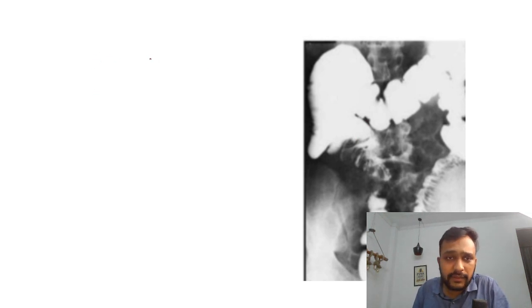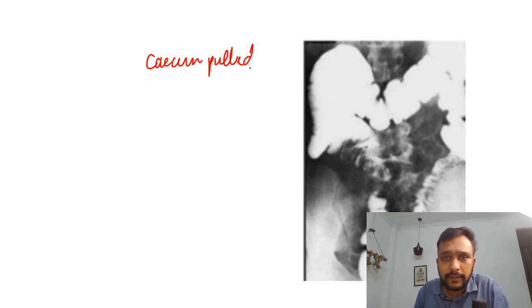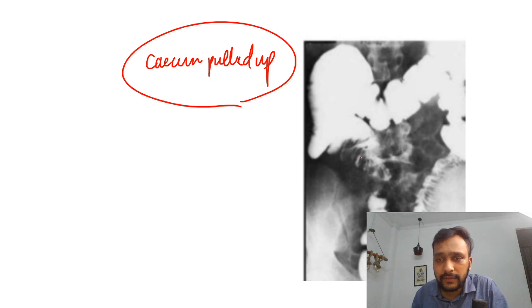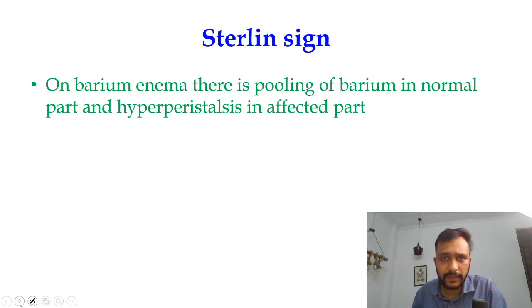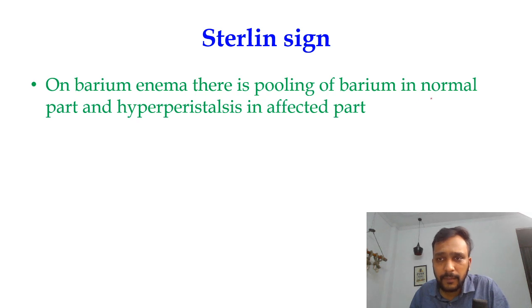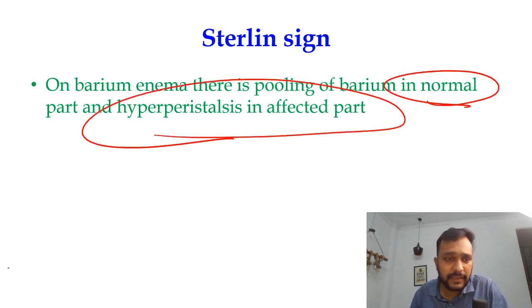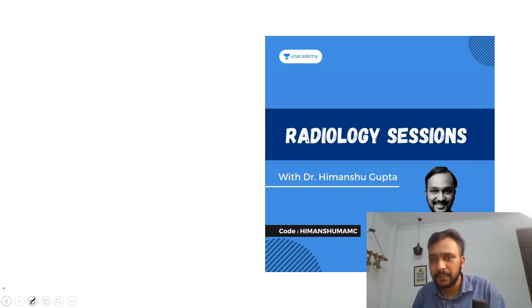In this barium meal follow-through image, you can see that the cecum is pulled up and the ileocecal angle is widened, giving the gooseneck deformity. Sterling sign refers to pooling of barium in a normal part and hyperperistalsis in the affected part.